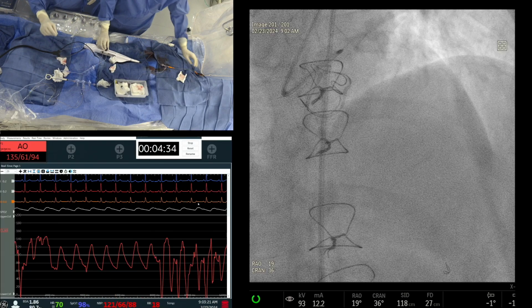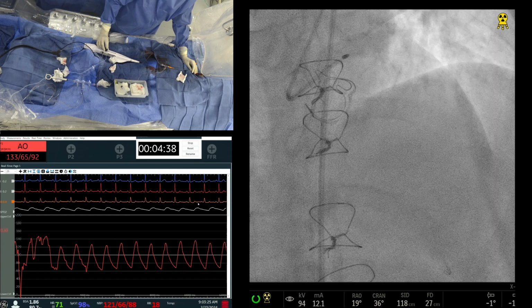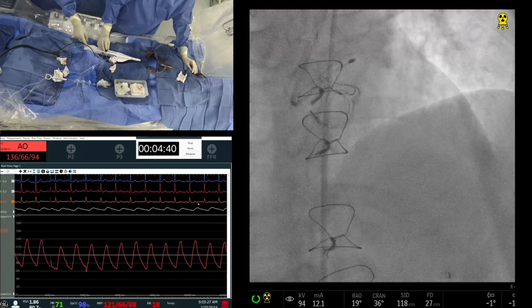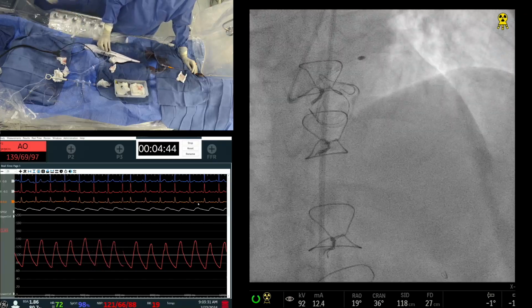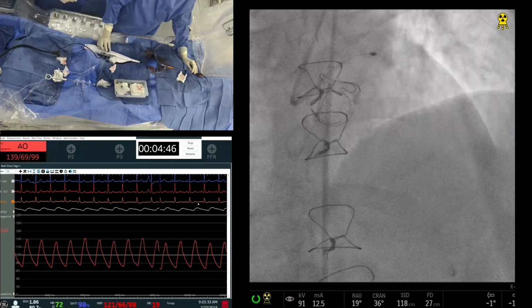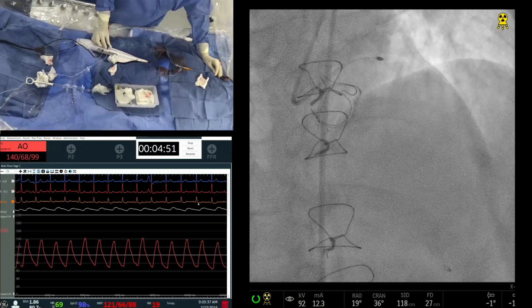What is the speed you keep it? Remember this Rota Pro comes set at 150. So I had done the company's setup, you don't even have to move. When you start, always start with 150. And that's where it is now. Fine. Good, that's good.